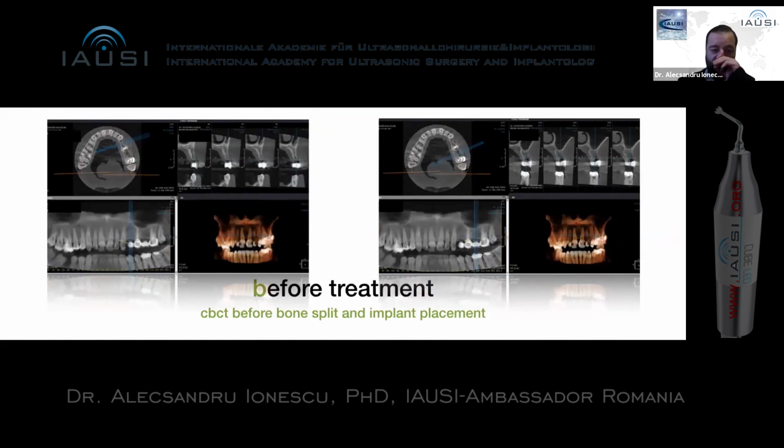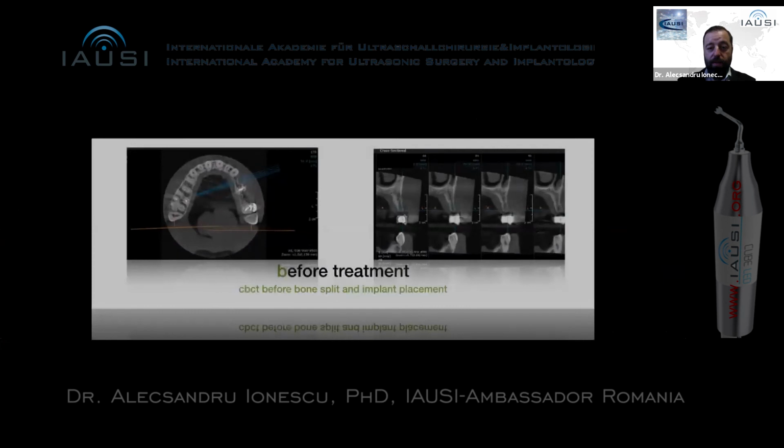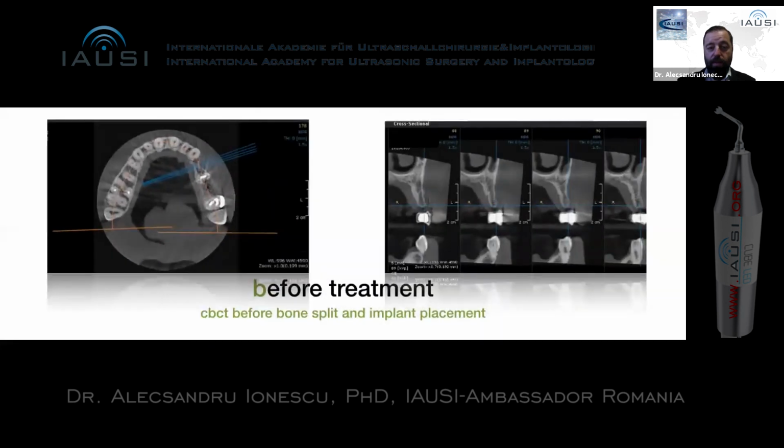Okay. One more case that we did, where we mixed the digital approach with Piezotome surgery. It's a case that we did before the pandemic. The patient came from Germany with this narrow crest. He's a doctor in Germany. We said, okay, we are trying to do something. We hoped that we would not have a new world rule with this pandemic, and unfortunately we now have one, but this was a discussion in March, right before the lockdown that we had.